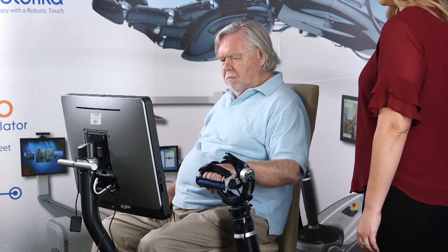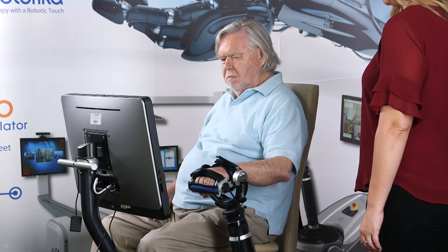While in a robotic session, that same patient can complete hundreds of repetitions with little physical strain to the therapist's body.